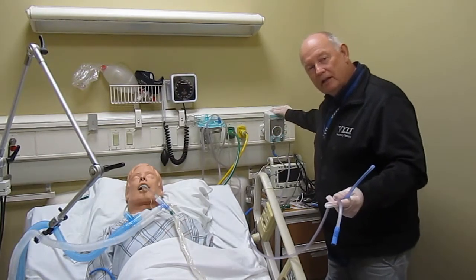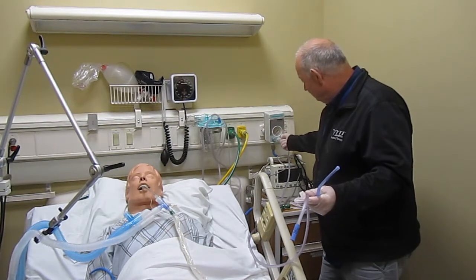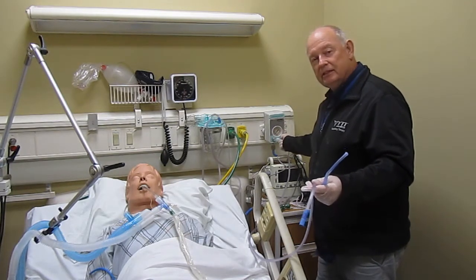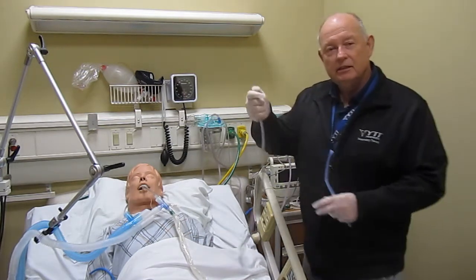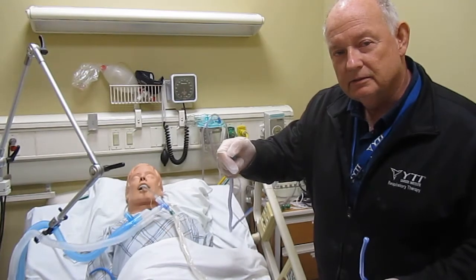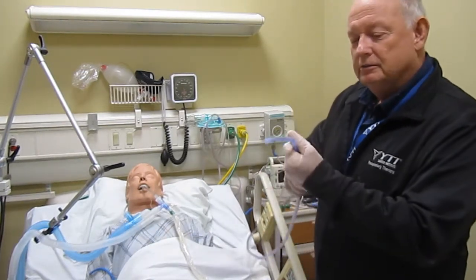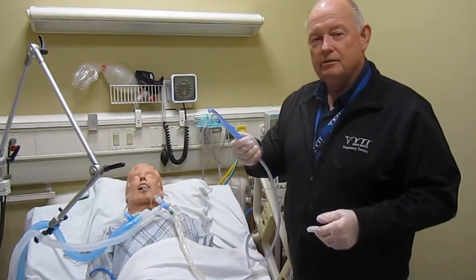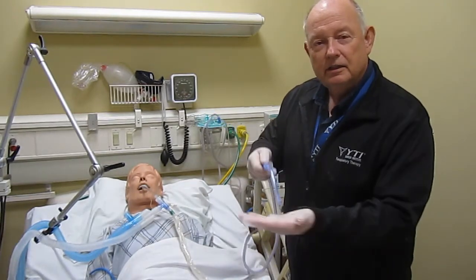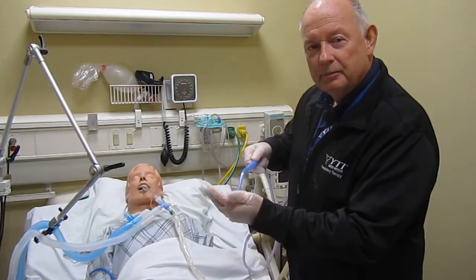The suction regulator has an on and off button. Off. Continuous. And it makes some noise. You put your Yankauer on. You can hit that on your hand to hear it working.